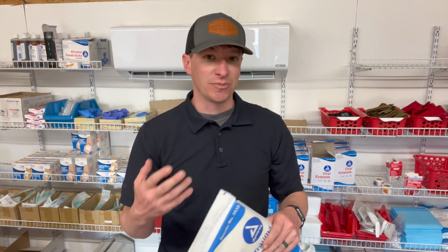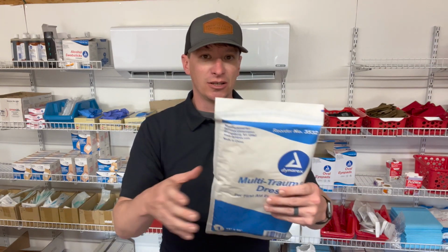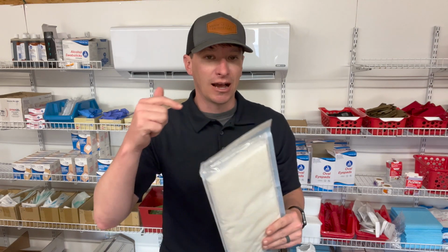I think I've used it when somebody got cut in glass and had a bunch of small cuts, nothing really major. So we just wrap it in this and then wrap some dressing around it and we're good to go. So this would be something good for your home kit or your vehicle kit to take a look at.